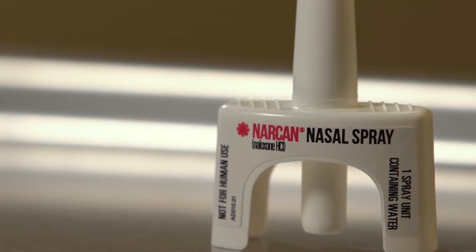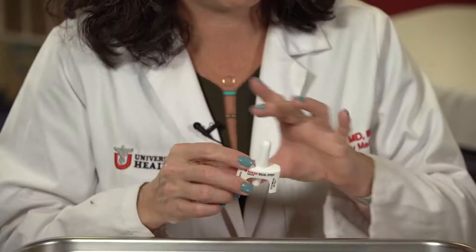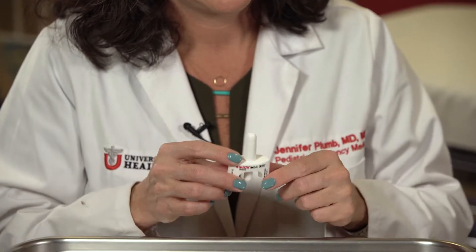Naloxone comes in a variety of forms. This device represents one of the intranasal forms that you may have. The medication is all preloaded into this device, and when it comes to you, it will have a plastic packaging over it. In order to administer it, you pull the label down, you place the cone in the nose, and you push.